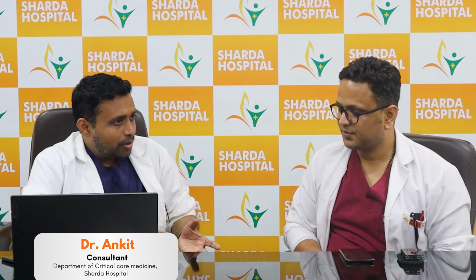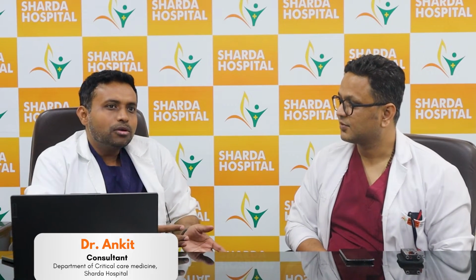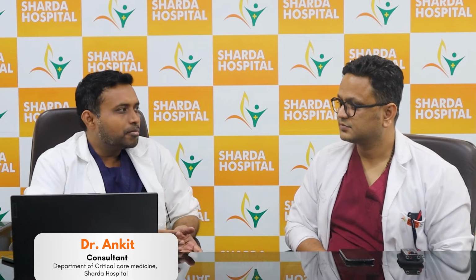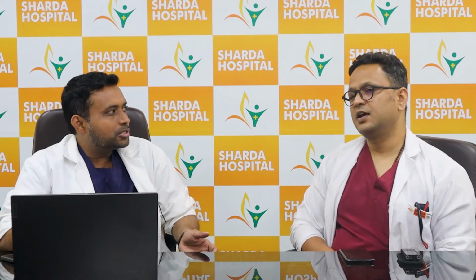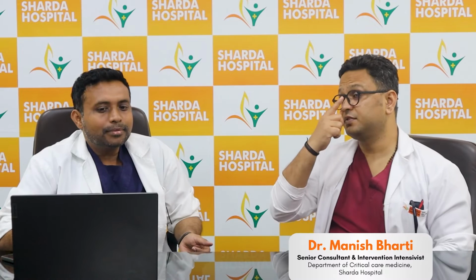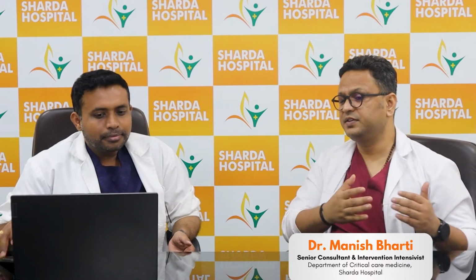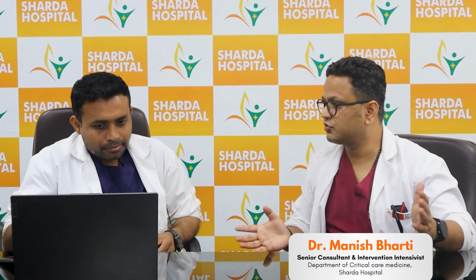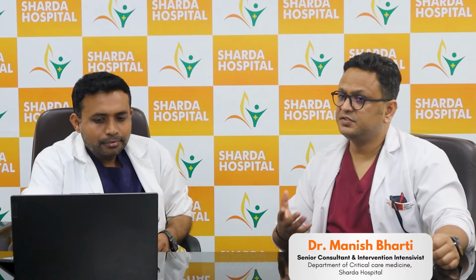So as we have learned about this bronchoscopy, in a medical setup we receive all sorts of patients, adult patients, pediatric patients. So in which age group of population is it helpful, any particular age group, or can we do it in all age groups of patients? So I think this is a very genuine question. So I would like to say, Dr. Ankit, these kinds of patients can be from all age groups. Okay. But as an expert intensivist in adult intensive care, we generally do it only for adult patients.